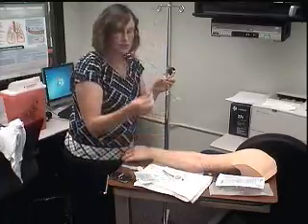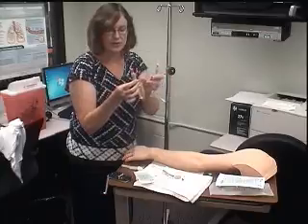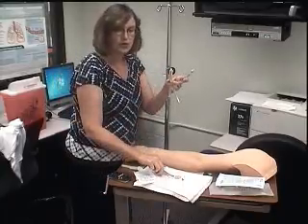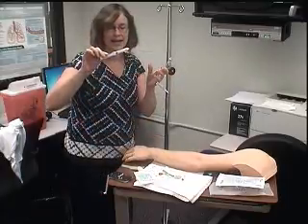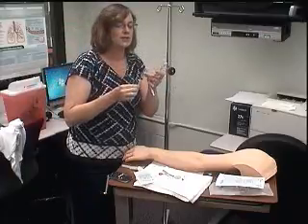I've got my brand new saline, and this comes with this unclamped. I would take the cap off of that. And of course, if you don't have these salines pre-filled, you know how to get saline out of a vial and into a syringe. You learned that in fundamentals.